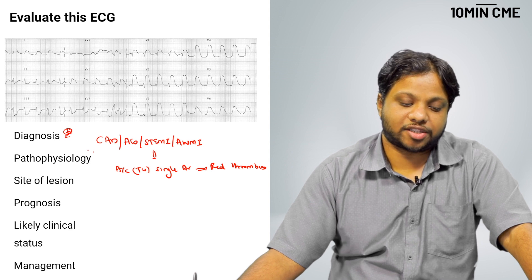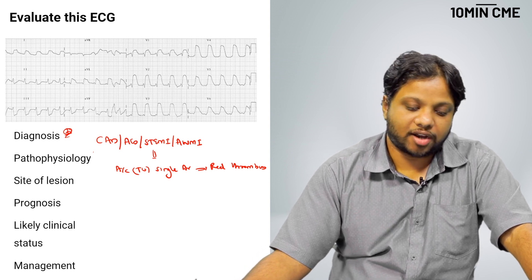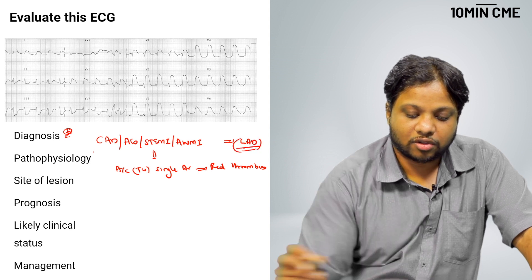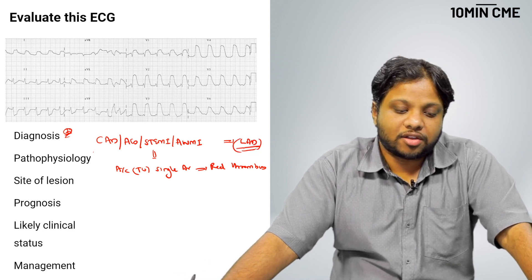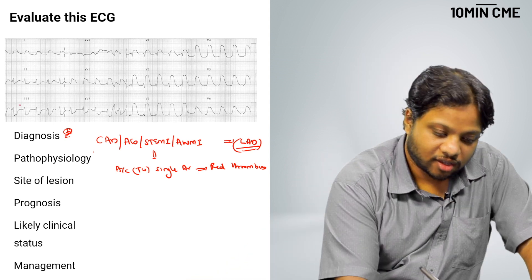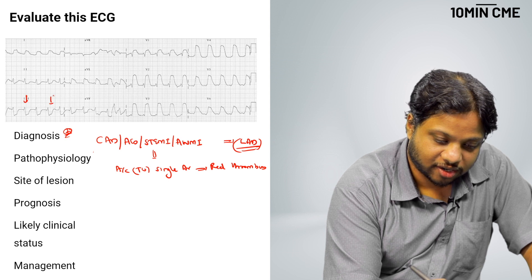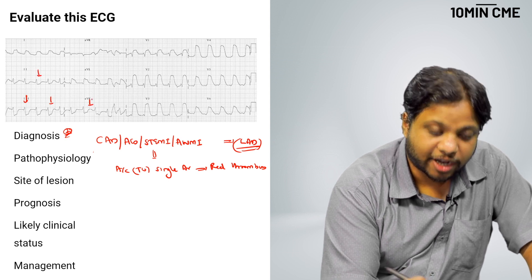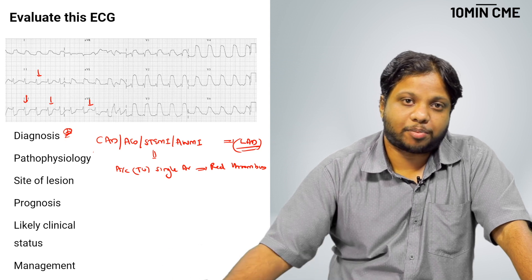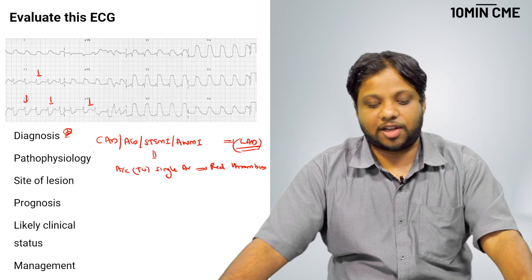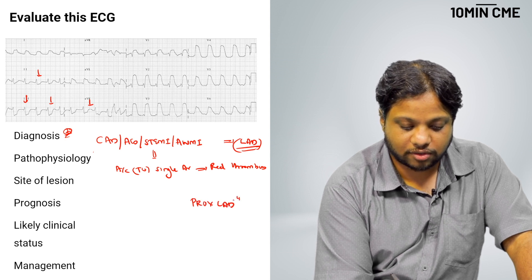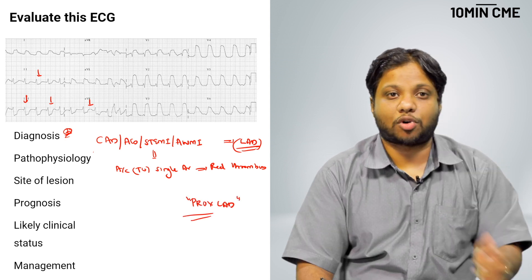Now, we come to the site of lesion. Since it is an anterolateral MI, only one possible artery can get occluded. It is the left anterior descending or the LAD. Where in the LAD? Whenever you get ST elevation in the anterior leads, you look at the inferior leads. If you see ST depression in the inferior leads, it might only be around 0.5 mm. It is obviously more here. When you see ST depression in the inferior leads, you localize it to the proximal LAD. This is a proximal LAD occlusion. Site of lesion is proximal LAD.